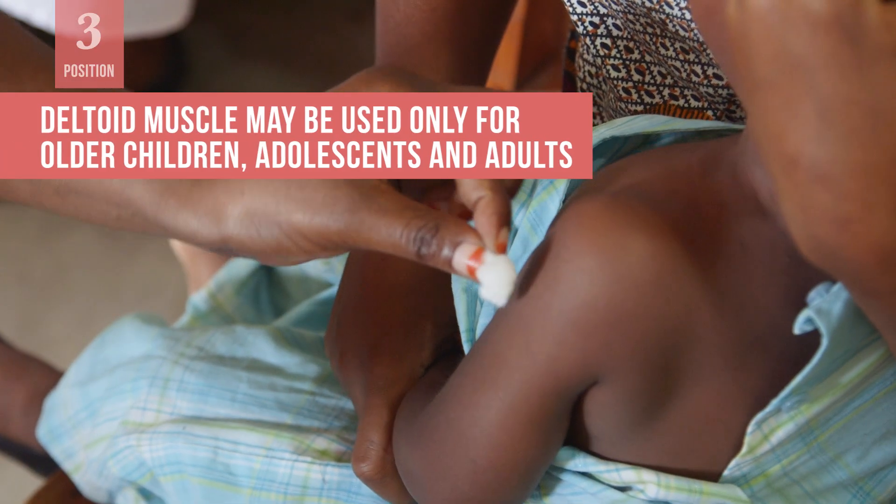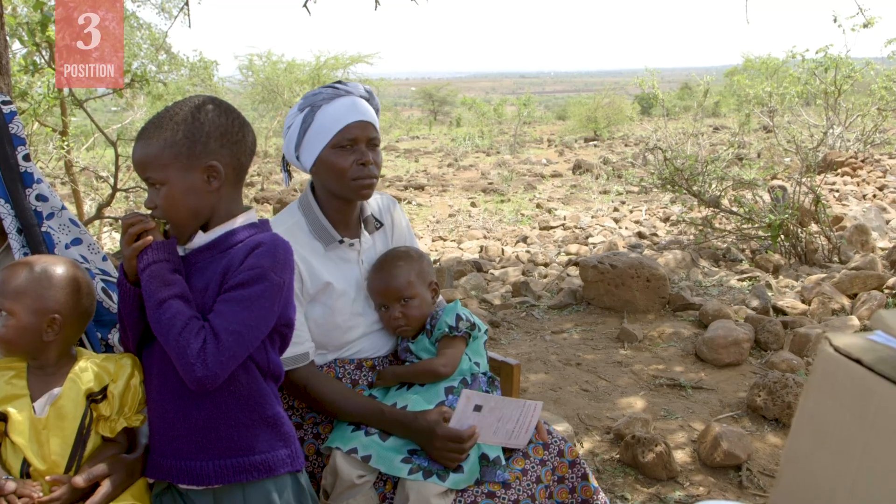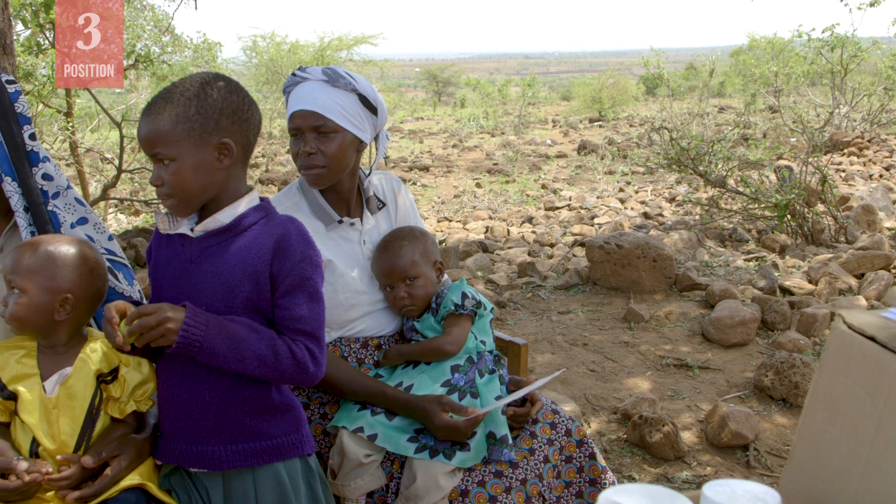You can use the deltoid muscle of the upper arm for older children, adolescents, and adults, but this is not safe for children aged less than 15 months.